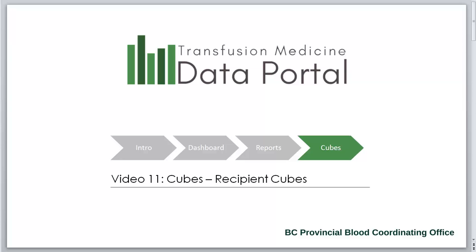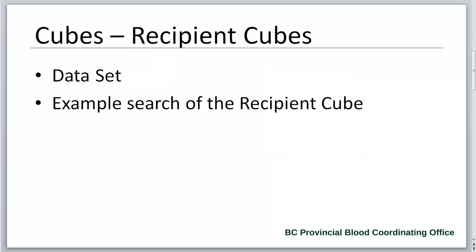These videos have been developed to support British Columbia's transfusion medicine staff and stakeholders in accessing and analyzing their transfusion medicine data from BC's Central Transfusion Registry. This video provides information about the data set in the recipient cubes of the Transfusion Medicine Data Portal and an example search.